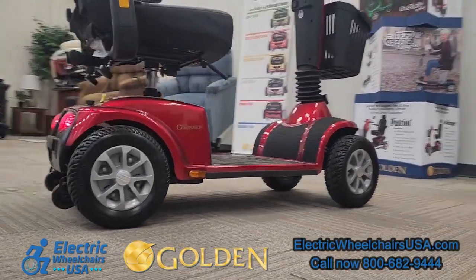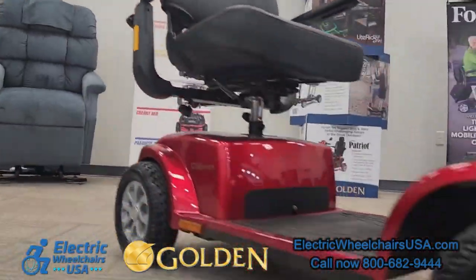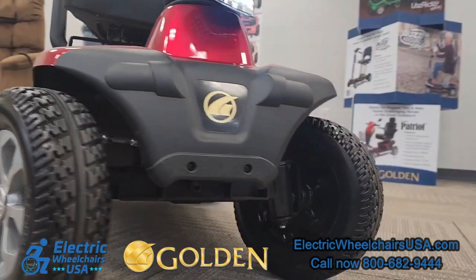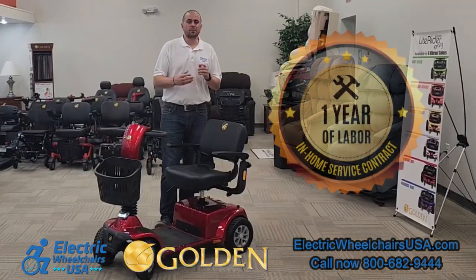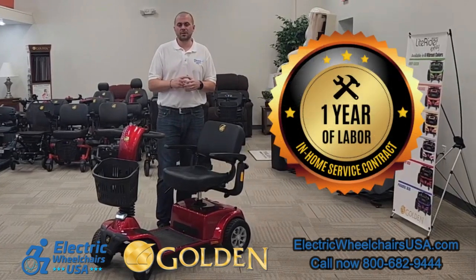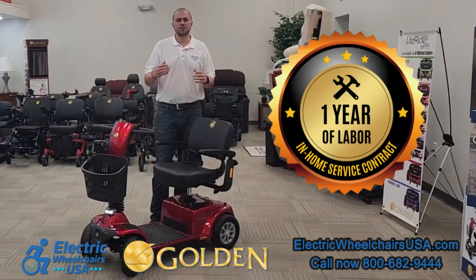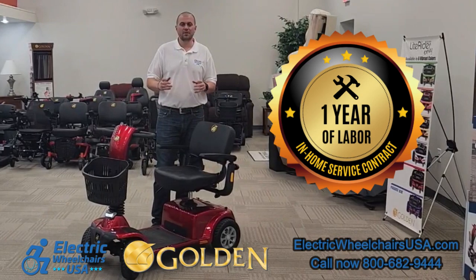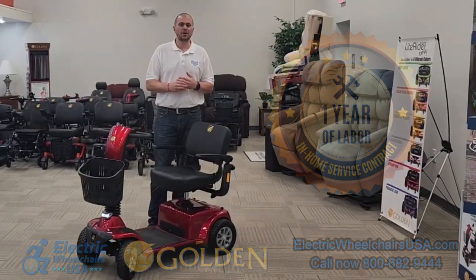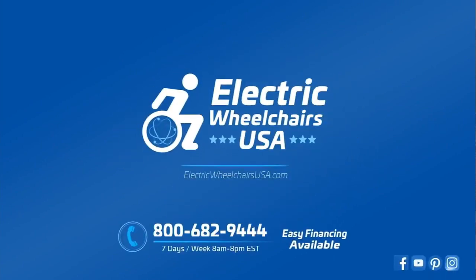If you're looking for a well-made full-size mobility scooter made by one of the best brands in the industry — dependable, with big tires — you can't go wrong with this scooter. Golden Technologies has one of the best warranties. It includes one year of in-home service for warranty-approved claims, where they dispatch a technician to your home to diagnose and resolve the issue. If you have any questions, feel free to give us a call at 1-800-682-9444 or visit us at electricwheelchairsusa.com.